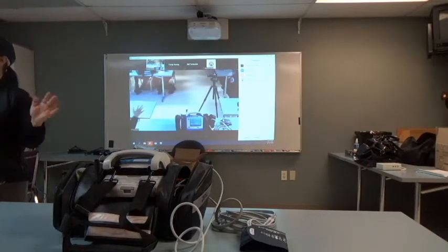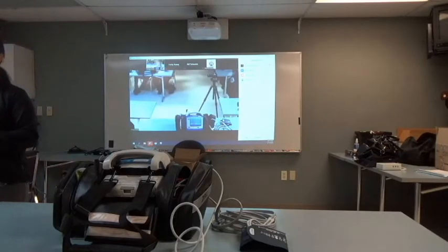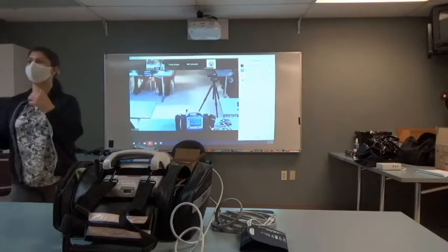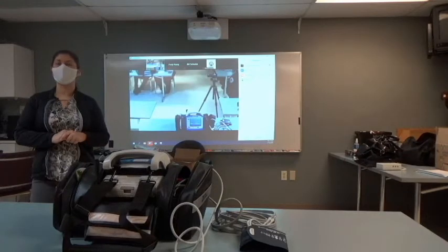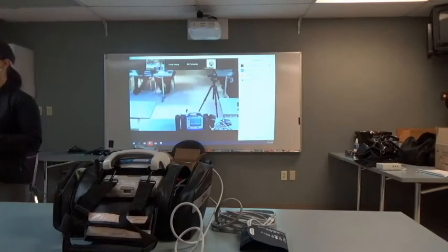So they just asked that we show you guys, so you were aware that it's there. Particularly if you accidentally hit it, you need to bounce out of that. It's important to know how to get out. We're gonna get into manual defibrillation now.